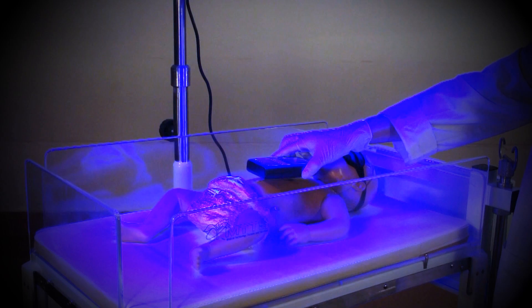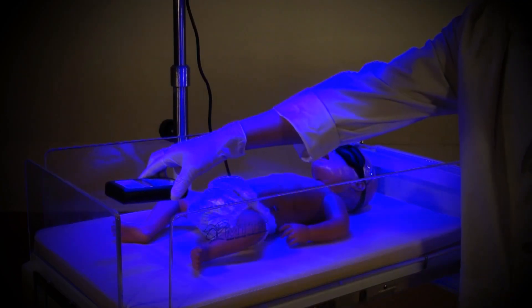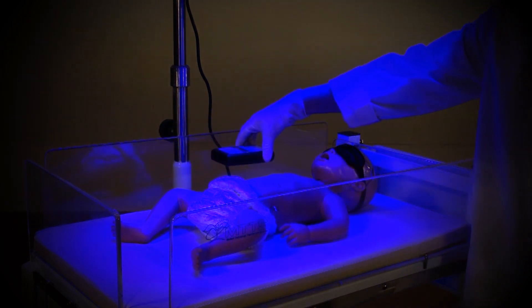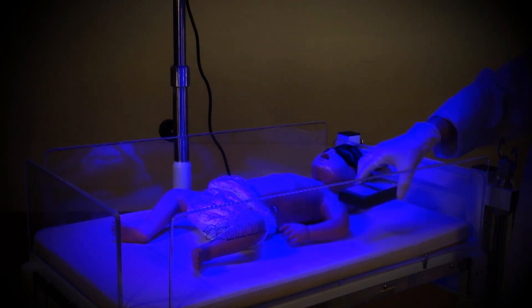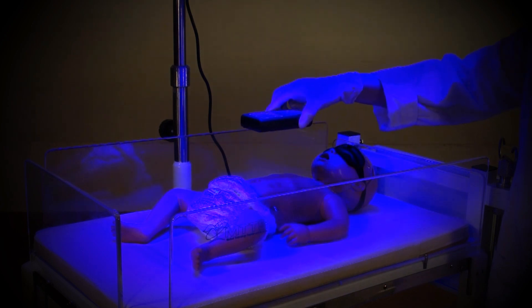Now move the light meter around slowly in all directions, like this. This will show that different positions can have different values, so you will see that positioning of the baby is very important to maximize therapeutic light exposure.